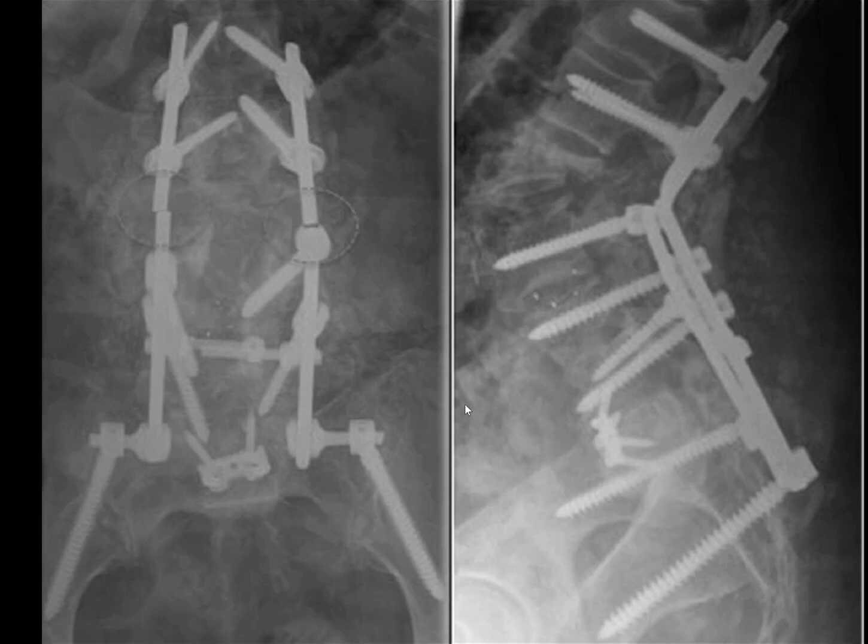This is another case where this patient had a pedicle subtraction osteotomy. So a lot of stress at just one area and everything fused, but because of the stress of the area, the rods broke. Probably because it never fused. This pedicle subtraction osteotomy, I think it's better when you do PSOs to try to remove the discs so it fuses in the front as well.